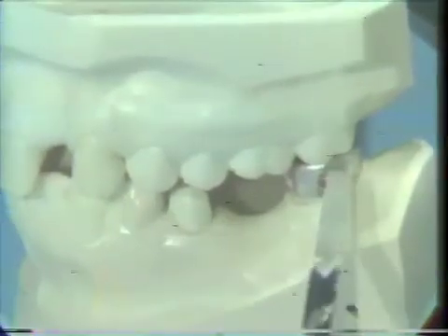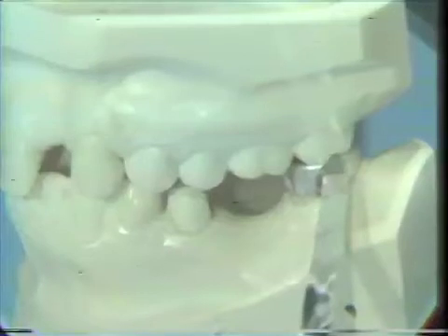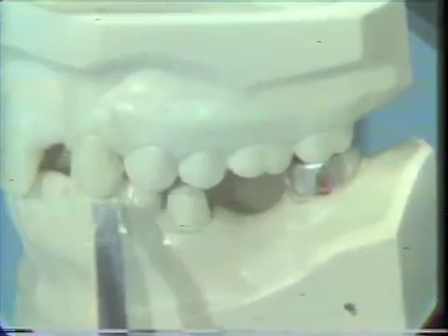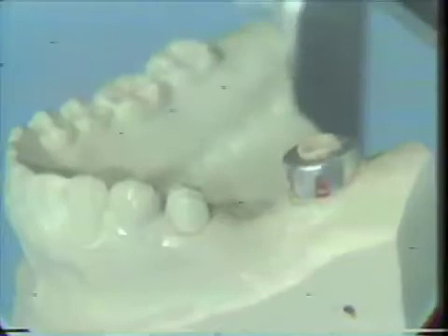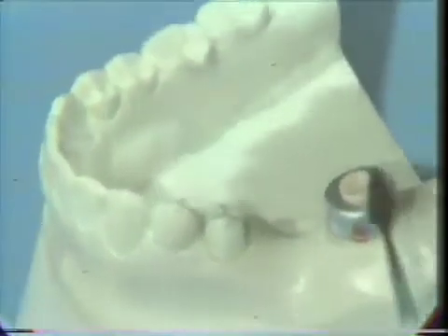If for some reason or other we have not completely seated this, or we do not have an absolutely accurate relationship so that we do have teeth contacting as we did originally, we can cut a small amount off of the occlusal surface and go back and do a wash with one of the ZOE materials so that we get a very accurate registration. And again, check those key teeth to make sure that we do have a contact as we did originally. And then we will use this, as I say, subsequently to mount our anatomic and functional cores.